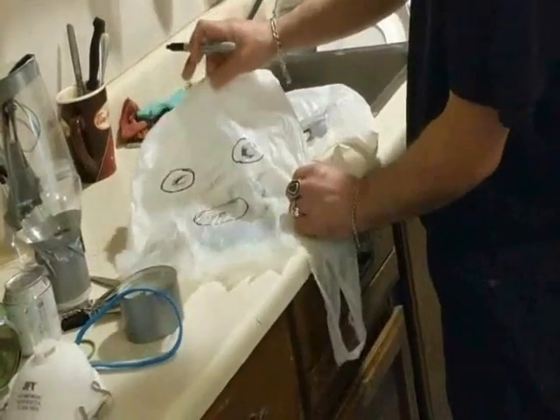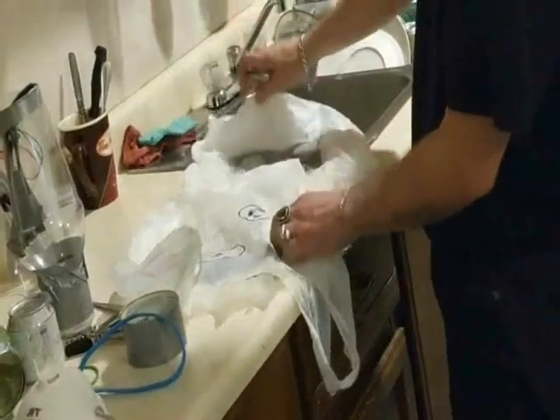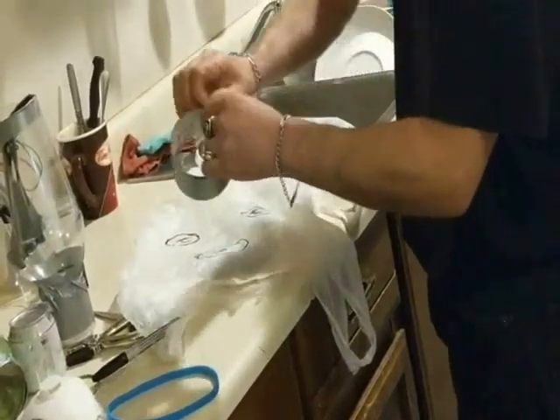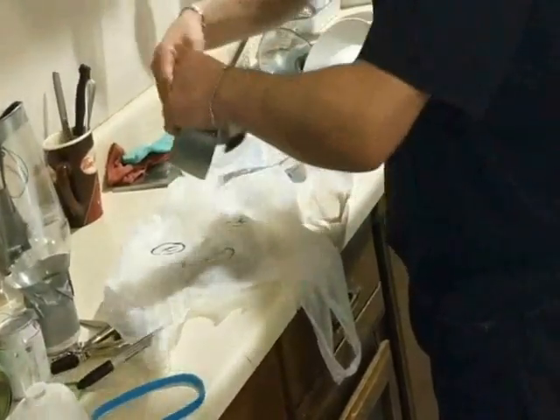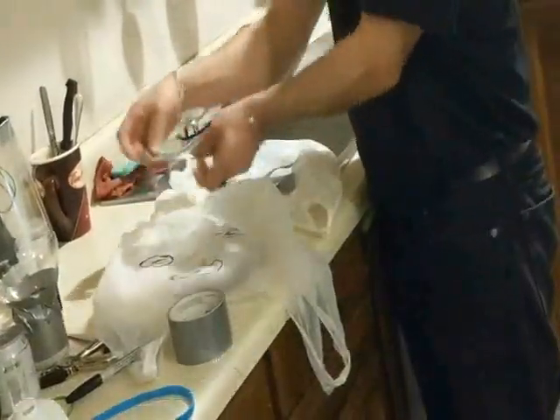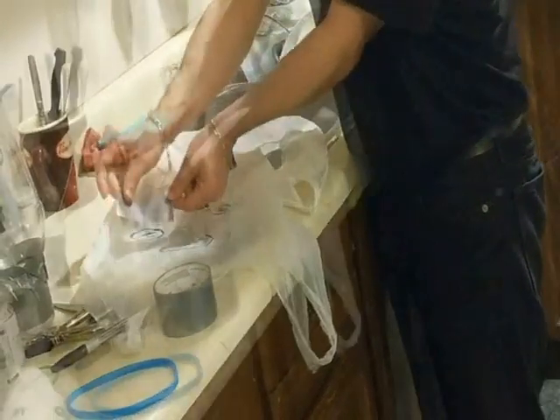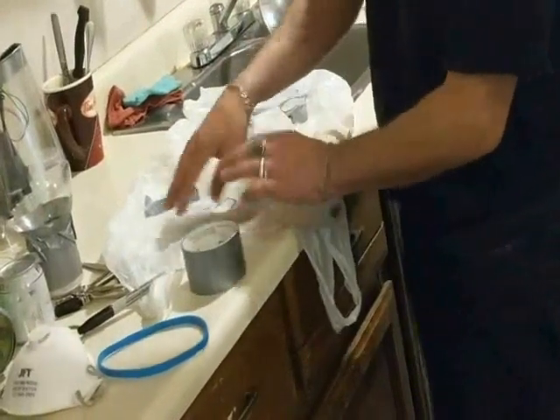Okay, so then what you do next is you'll be putting a piece of duct tape. Now you want it even with your eye. You don't want to line it up like that, off. You don't want to line it too high or too low. So that's where you're going to be. Okay, that's one. You do the same with the other eye and your mouth.